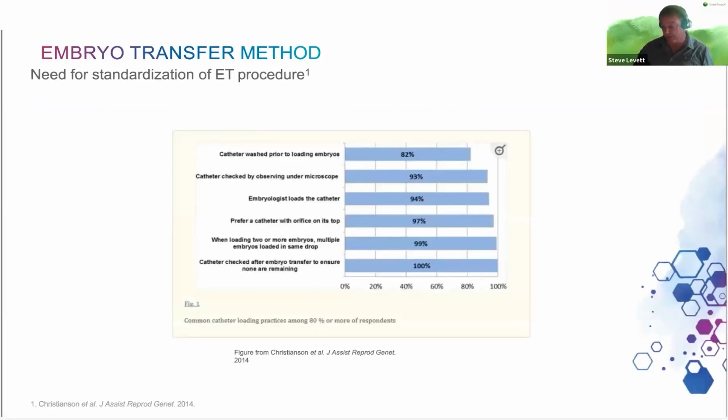So how to perform an embryo transfer? As I mentioned, there's no real standardization out there that we can follow. And when you look at surveys that have been done and documented papers, etc., there are some things that everybody does and that most do, but there is no real consensus.